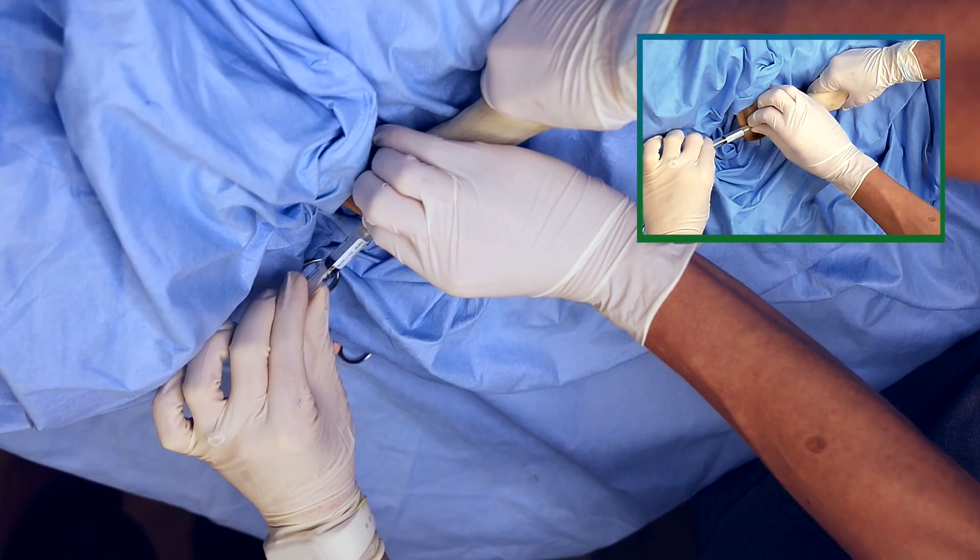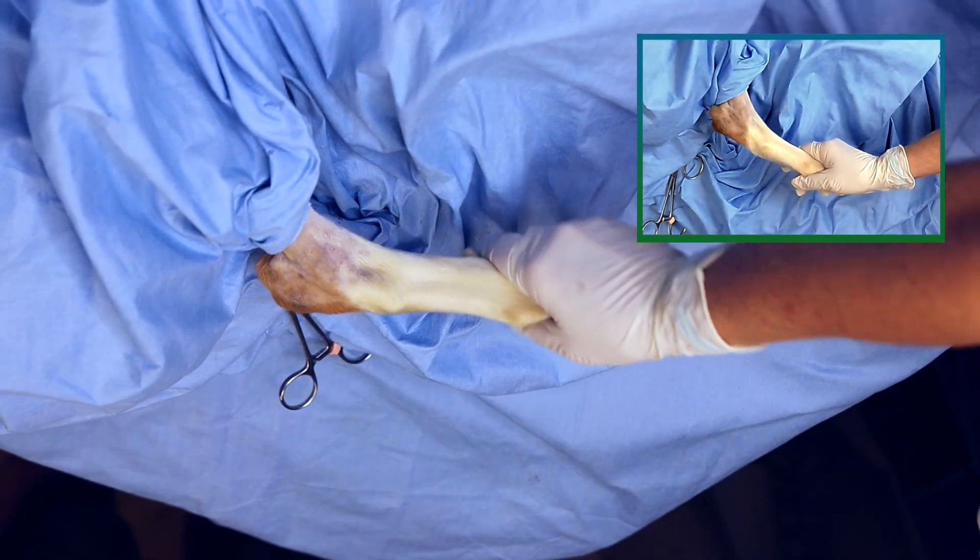After your injection, perform gentle range of motion flexion and extension to distribute your product.